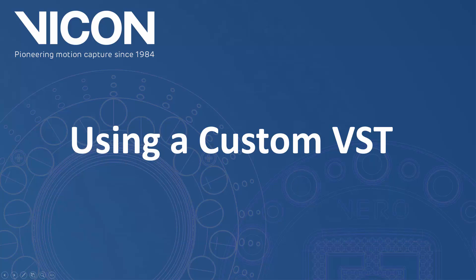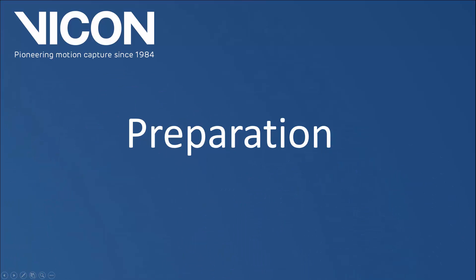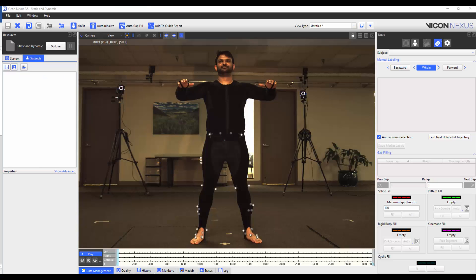Welcome to the Nexus 2 help guide. In this video we will be using a custom VST that we have made in a previous video so that we can use the auto label feature. We have placed the same marker set as the previous video onto our new subject. These are marker clusters on the pelvis, thighs, tibias and feet.